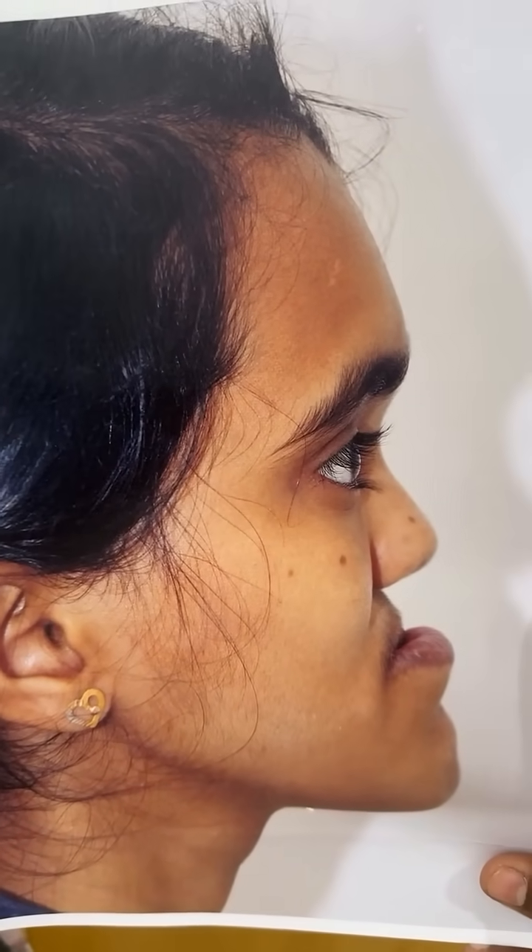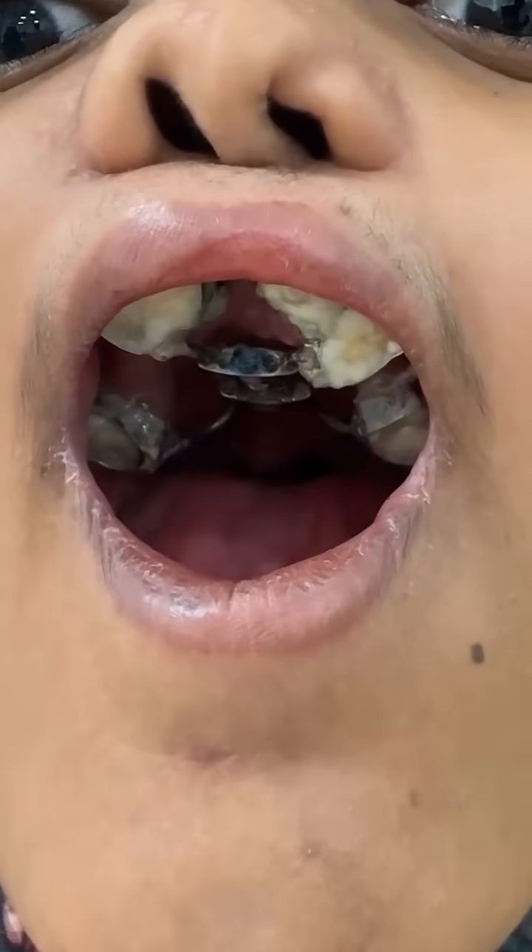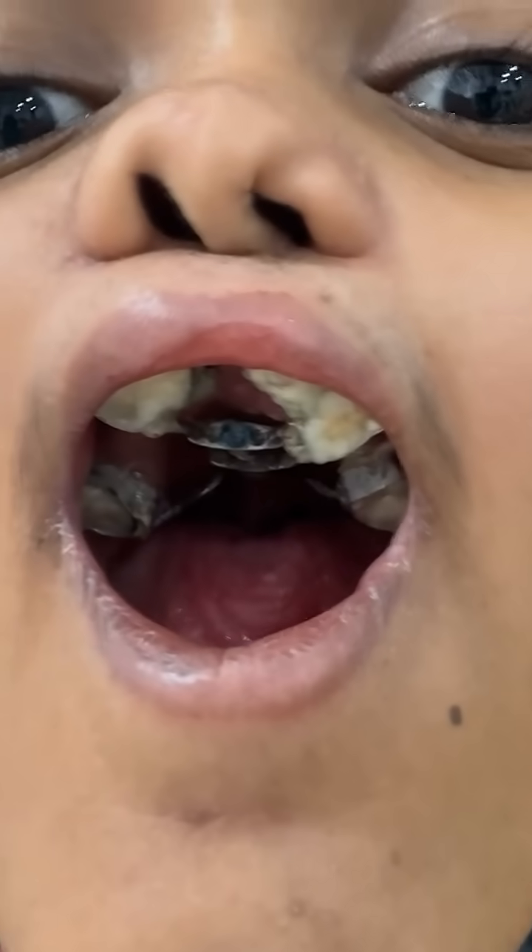I want to show you the pre-op one more time. This face-changing, life-changing surgery has been brought about with the help of patient-specific distractors. I'm going to show you what she's wearing inside the mouth — this is what has done the amazing change for her. Of course, it's a surgery wherein we've done the osteotomy.